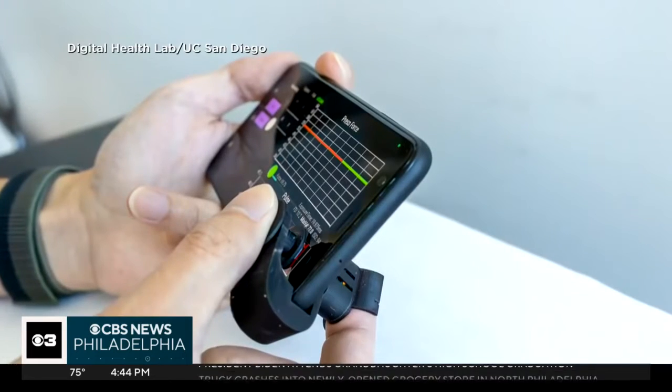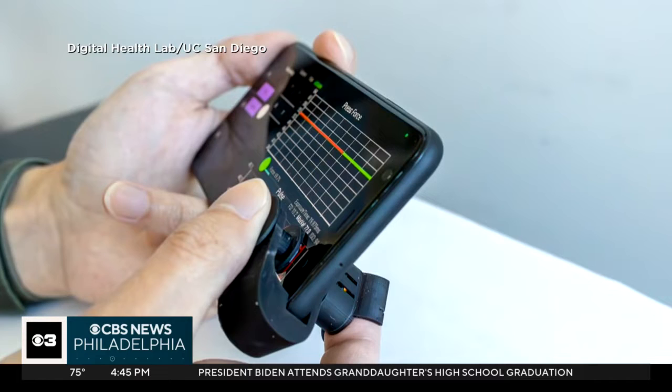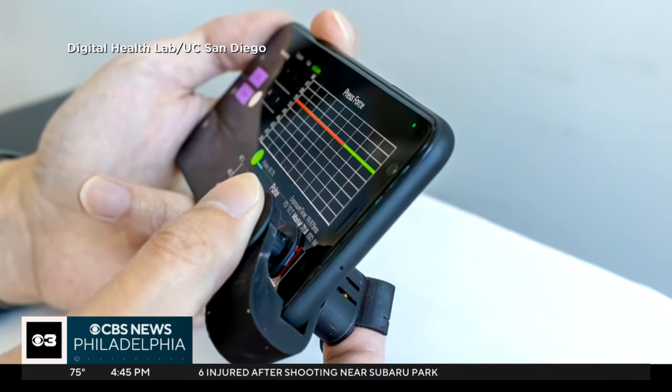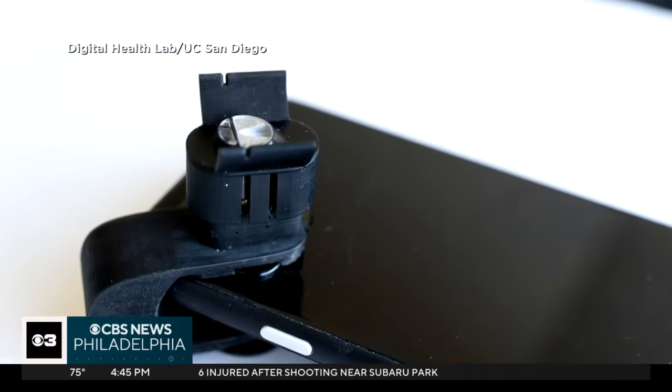Millions of people need to regularly check their blood pressure. Most use at-home cuffs, similar to what you see in a doctor's office. But now it can be done with your fingers and a smartphone. Engineers at the University of California, San Diego have developed a new smartphone attachment that brings blood pressure monitoring to your fingertips. It's a 3D plastic clip that uses the phone's camera to monitor blood pressure.